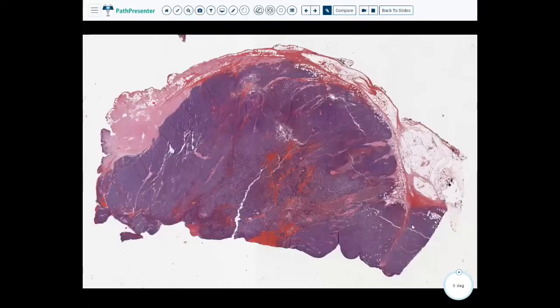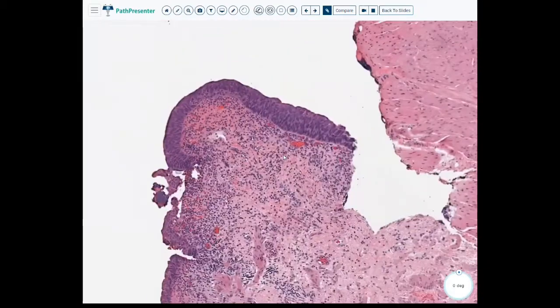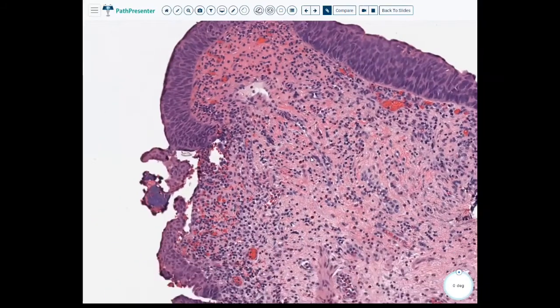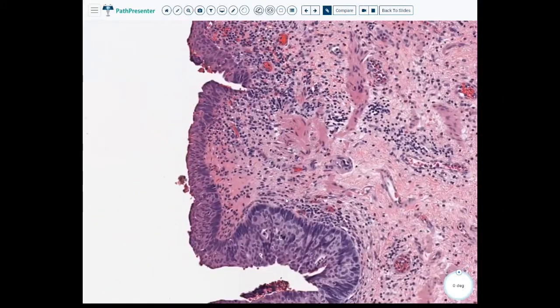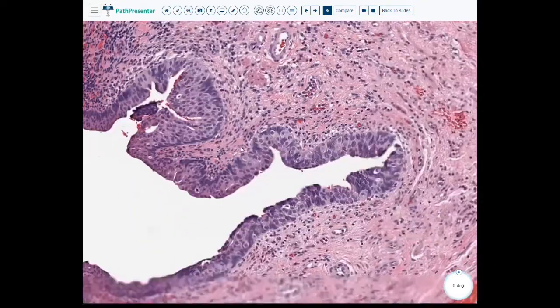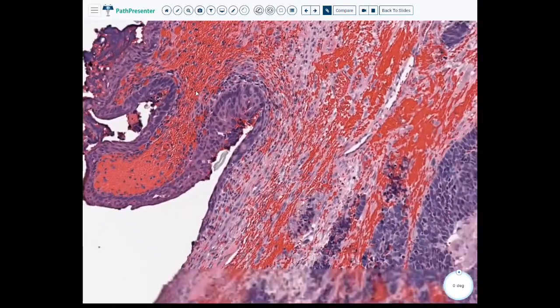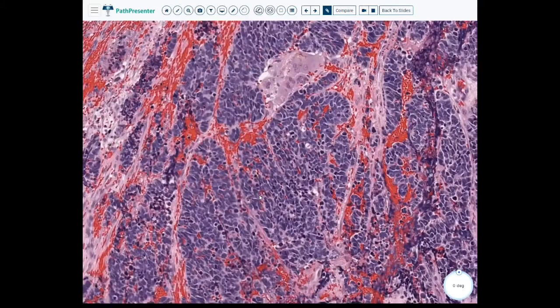Case 11. So extremely blue. And this is a complete cross section. This looks like we have a nice layer of fat, this looks like muscle, and this looks like urothelium over here. So let's take a look at our urothelium. Okay. It's darkly stained, but the urothelium generally looks intact. And then we get to our lesion.